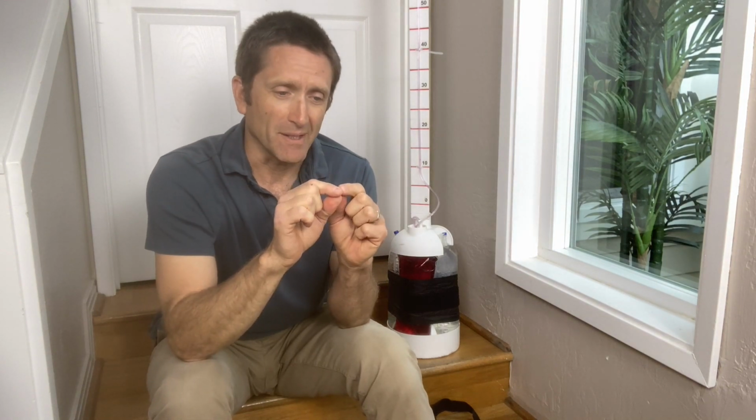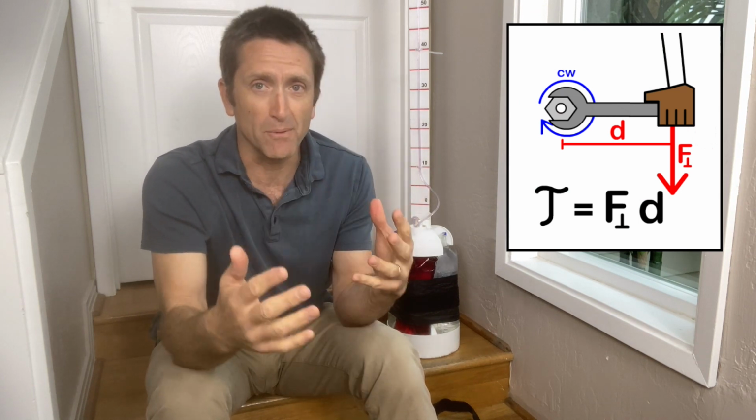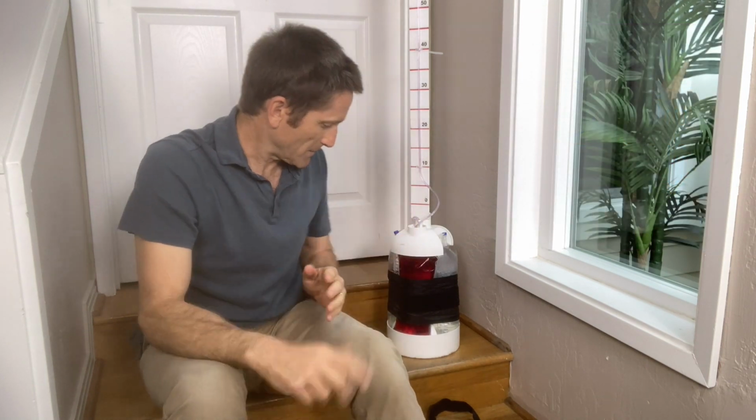My friend Sam here. So today I want to be doing some torque testing, and torque is the product of radius times force. So that's why it's foot-pounds or Newton meters. I like Newton meters, metric.